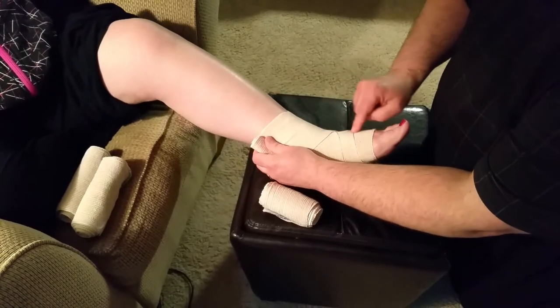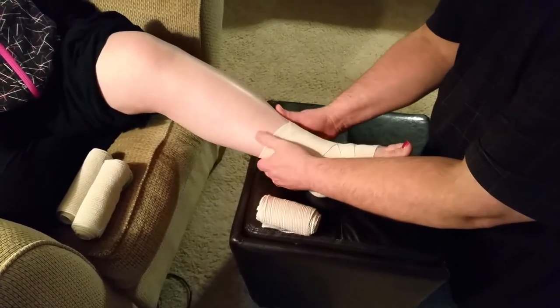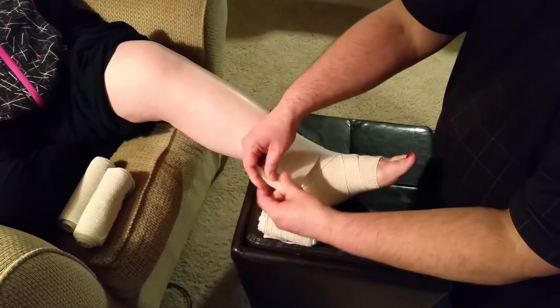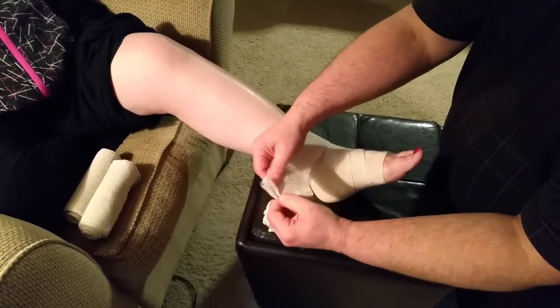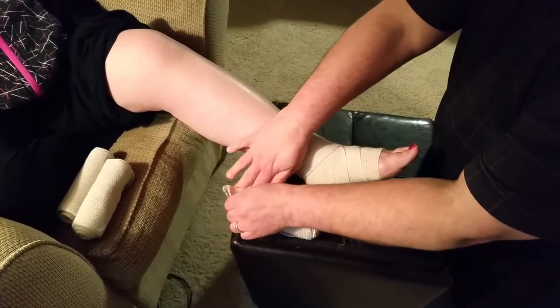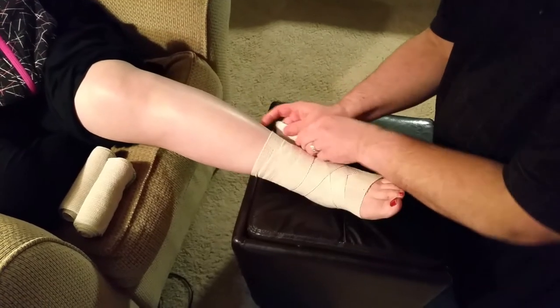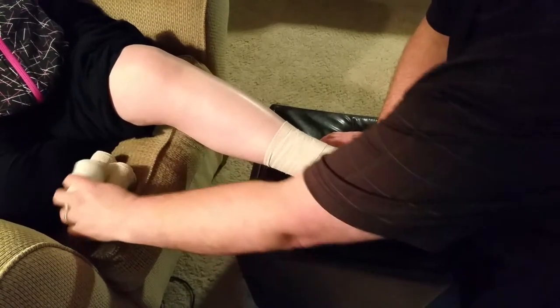You can see the herringbone pattern starting right here — that's what you use to go around the ankle. When you don't have enough to go around again, open it up; it has velcro here that will seal it as you come around the rest of the way, and it seals right here.